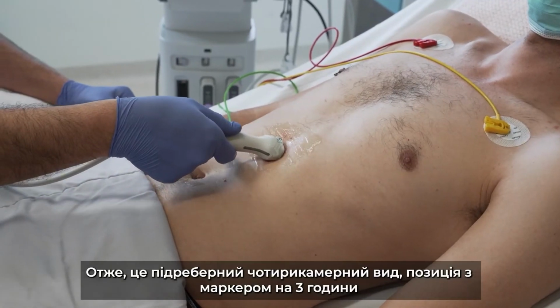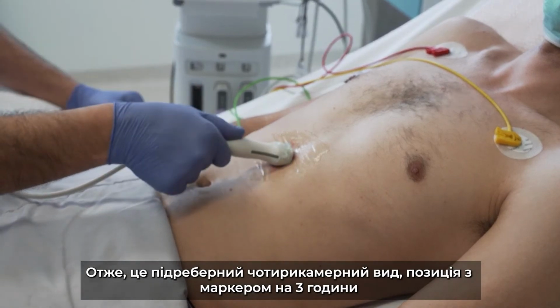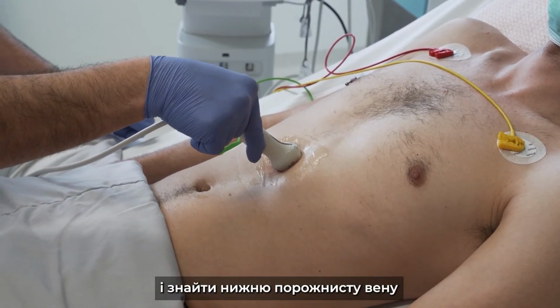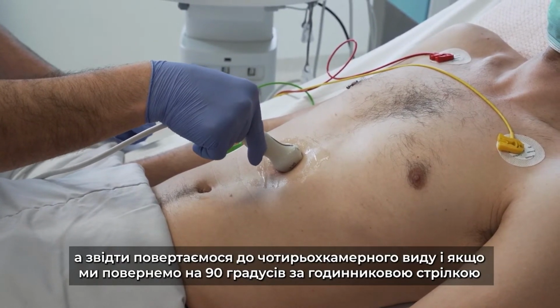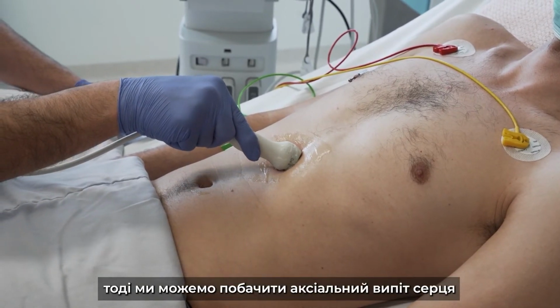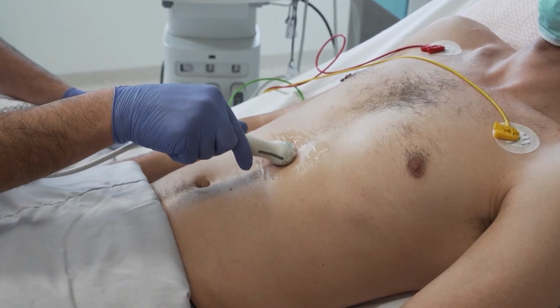So this is the subcostal four-chamber view position with the marker. This is the marker at 3 o'clock. From here we can rotate anti-clockwise 90 degrees with a slight tilt, and then we can see the vena cava inferior. From there we go back to the four-chamber view, and if we rotate 90 degrees clockwise, then we can see the axial views of the heart. That concludes the subcostal window.